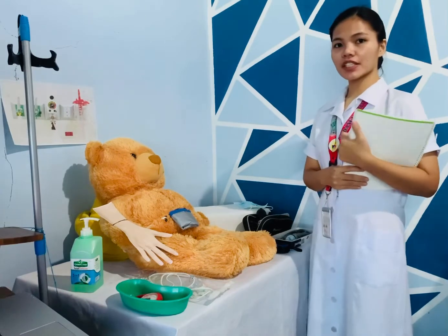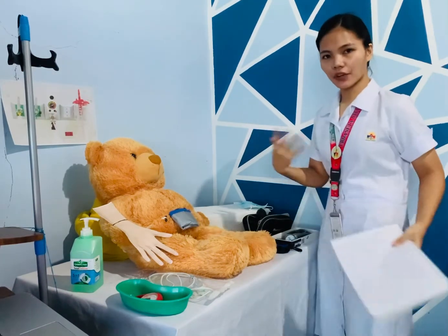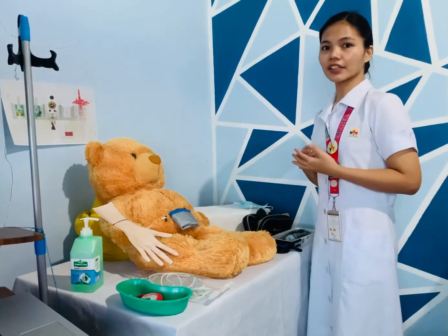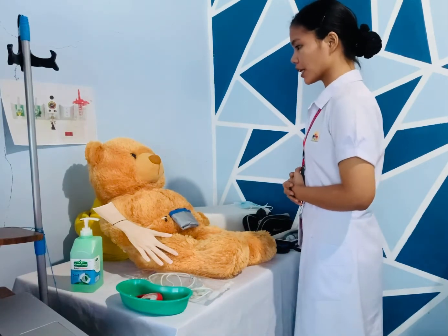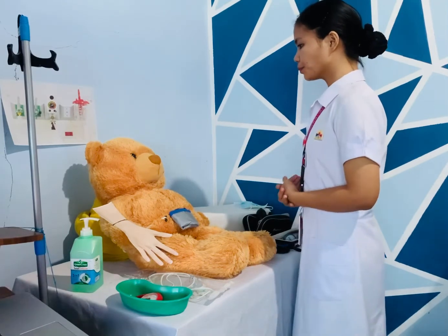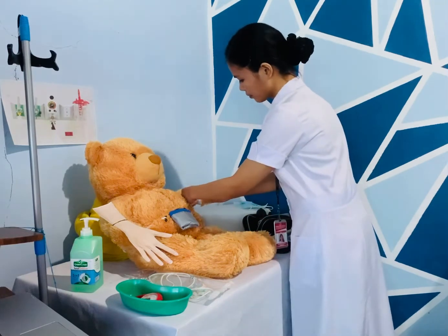Okay, so first check the doctor's order. Then after that, greet, introduce, identify, and explain. Hello ma'am, good morning. I'm Jermin Marquez. I will be your nurse for today. May I know your name and your date of birth po? Okay, pacheck na lang po ng wristband ninyo.